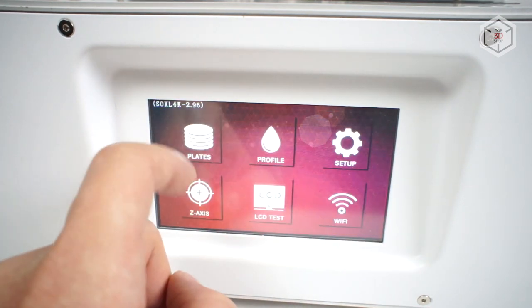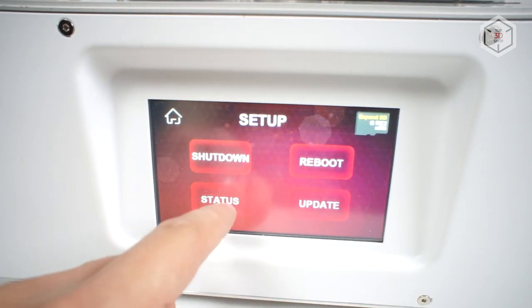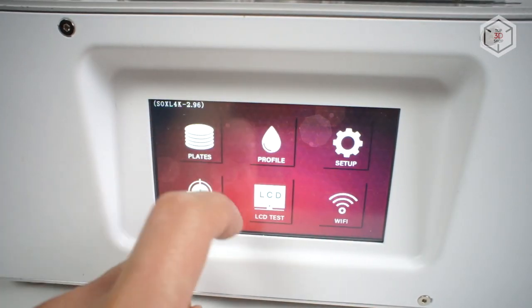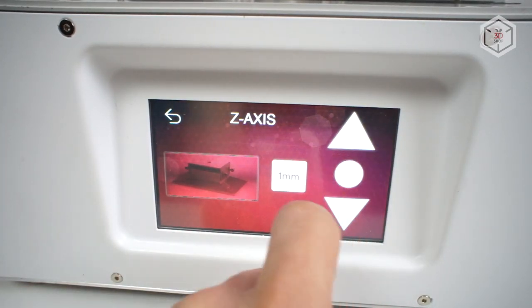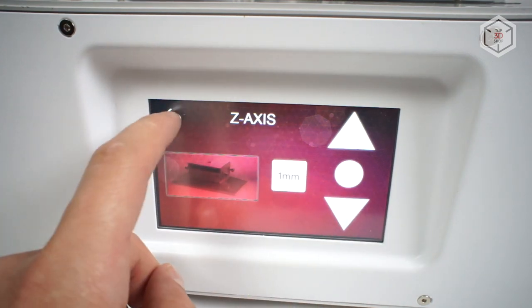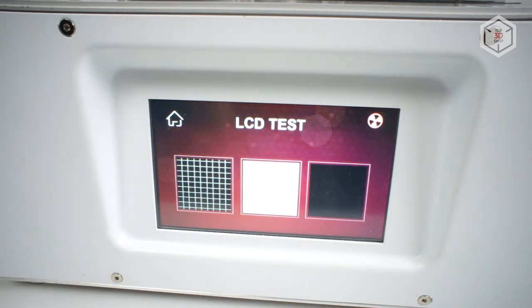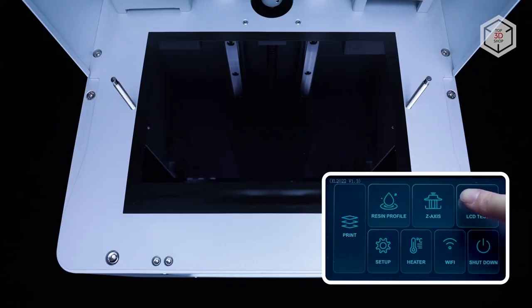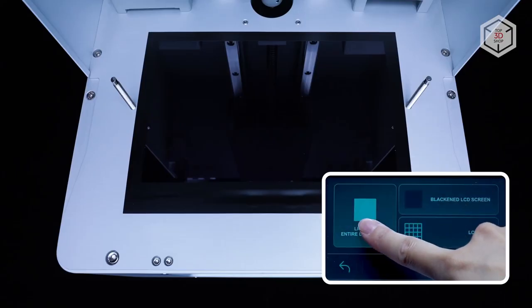status, and update functions. Since the machine is run by an Orange Pi board, it is advisable to turn off and restart the printer through this menu. The Z-axis tab is responsible for the Z-axis manual movement and calibration. There are also tabs for checking the lighting module and wireless network settings. The touchscreen menu has been completely redesigned in the updated version of the printer.